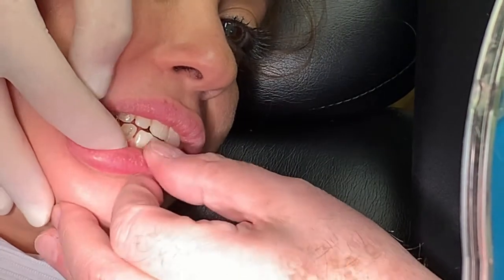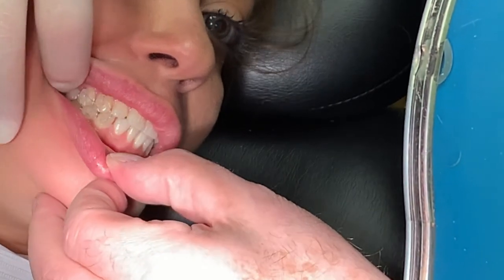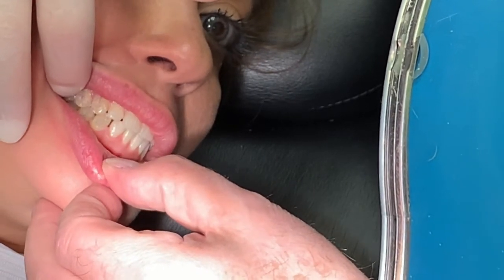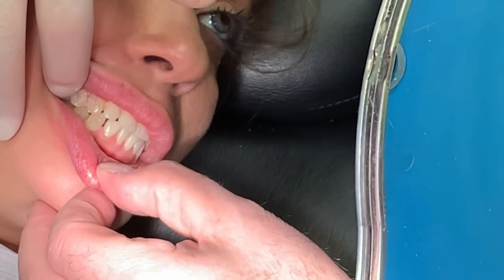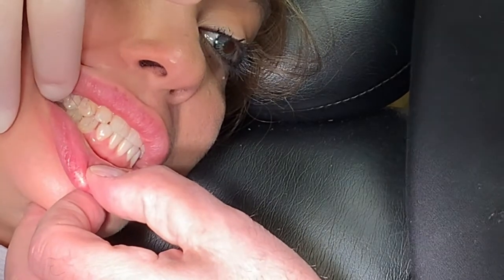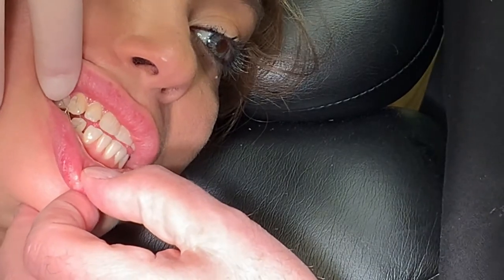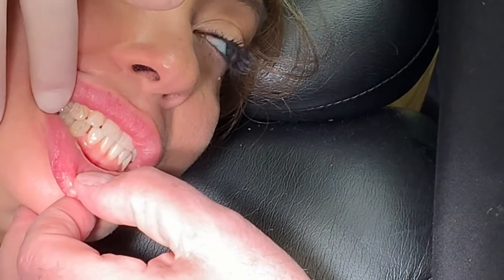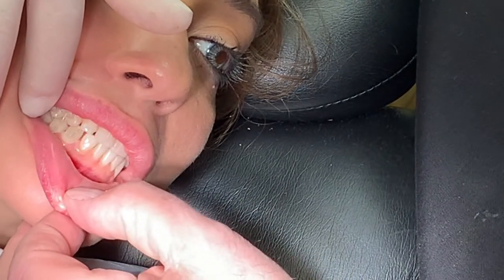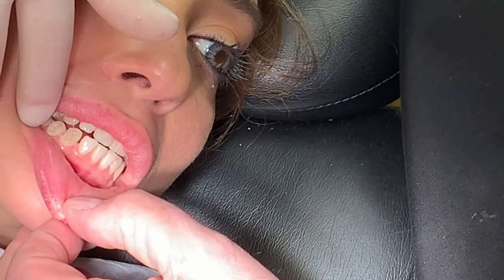Done. Now, you can move your jaw to the right, to the left, open, front and back. That's called your envelope of motion. If you tighten the wire too much, you will close down the envelope of motion and you won't be able to speak. If you open it too much, make the wire too lax, the wire will spill off and you have to do it again. Once again, open, close, to the right, to the left, forward, and back.